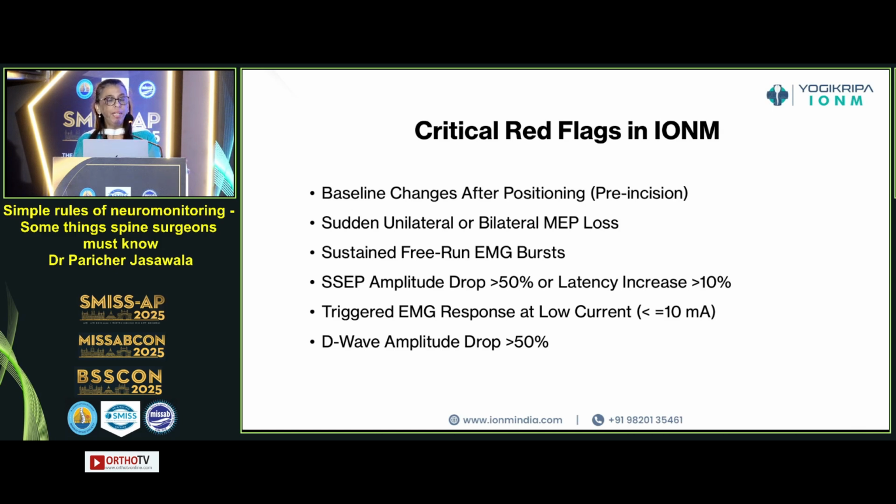Then sustained free run EMG burst. If it goes on continuously, then you have to inform the surgeon, and he has to see whether there is any retraction which is pressing upon the nerve roots, or any patty, or any blood clots, or anything, so that we do not lose time and action is taken immediately.